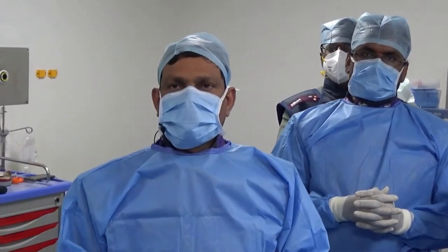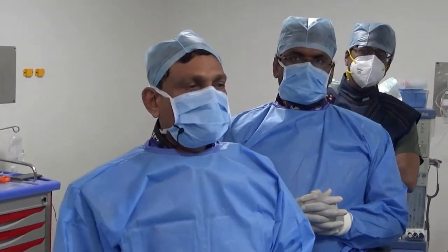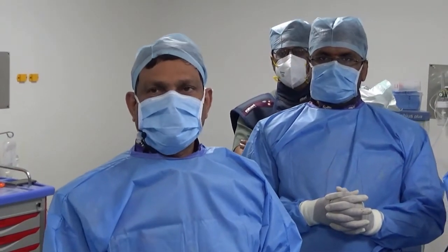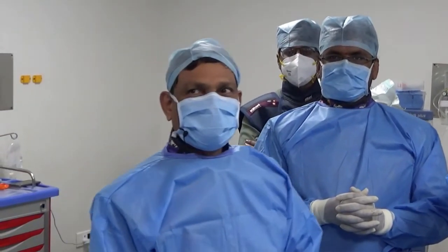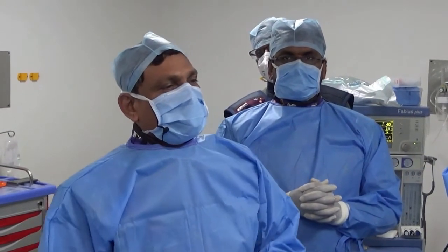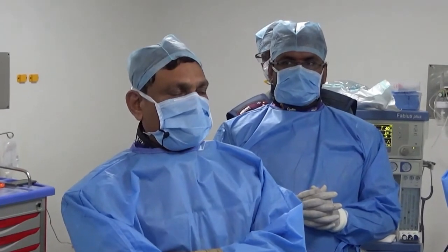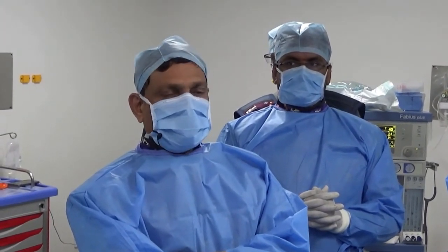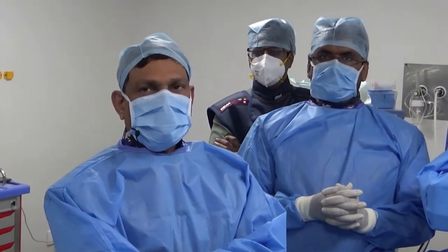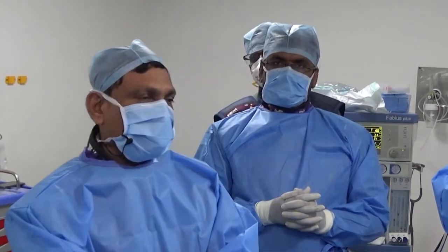Does anyone else have an alternative thought? Nageshwar, how to do this? Nageshwar? Good evening. Nice to hear your voice. I am seeing you also, luckily. Thank you. Why did you not think of doing it only from the venous approach? Why did you electively take the 6? We can do it from the jugular vein. I do agree, but I can't do it from the femoral vein because this is a posterior one. Femoral vein is not at all an option here. We also had a couple of them. I think we have always done it through the jugular only.